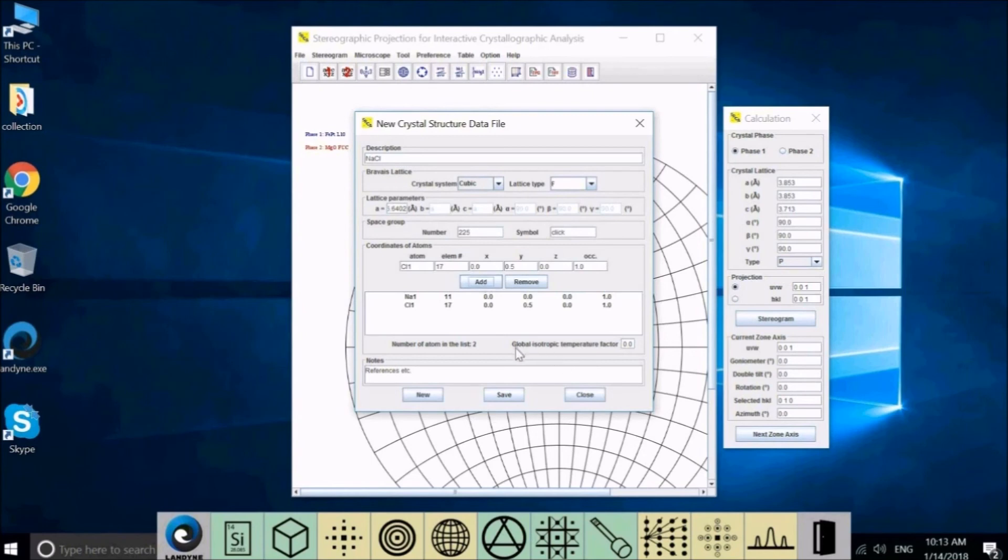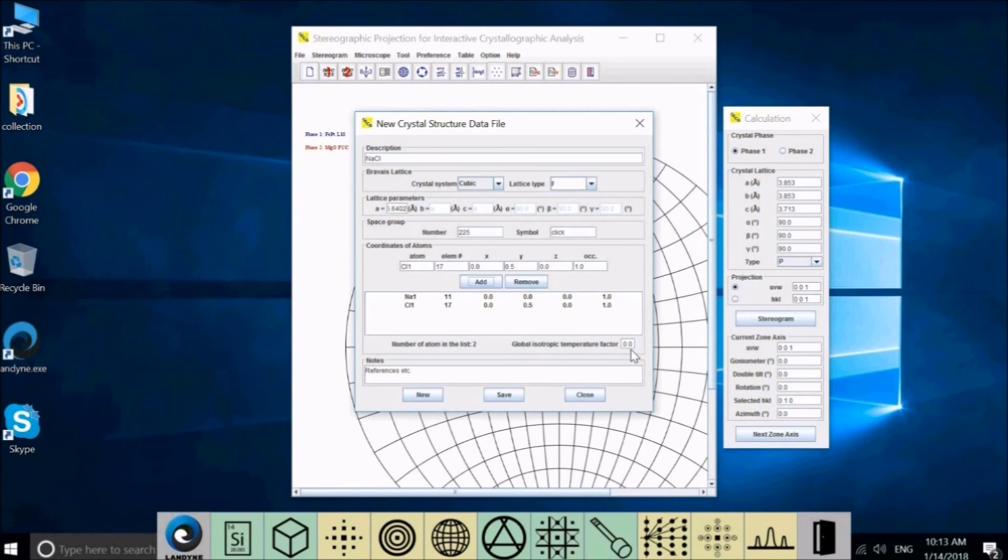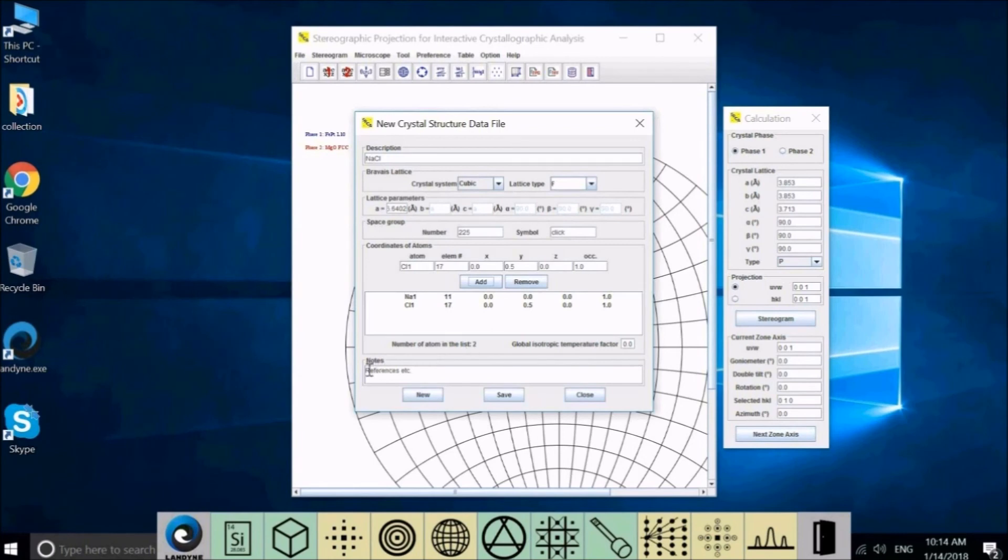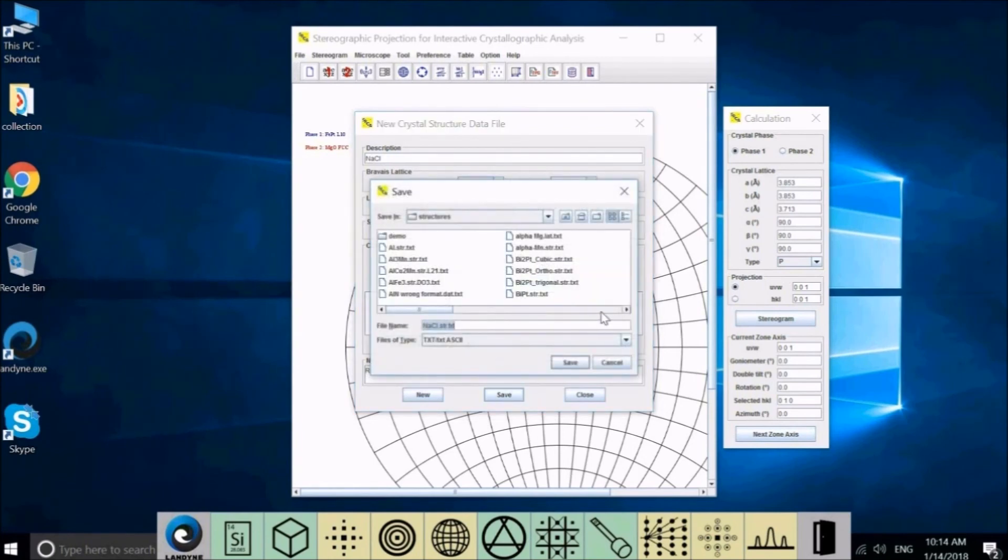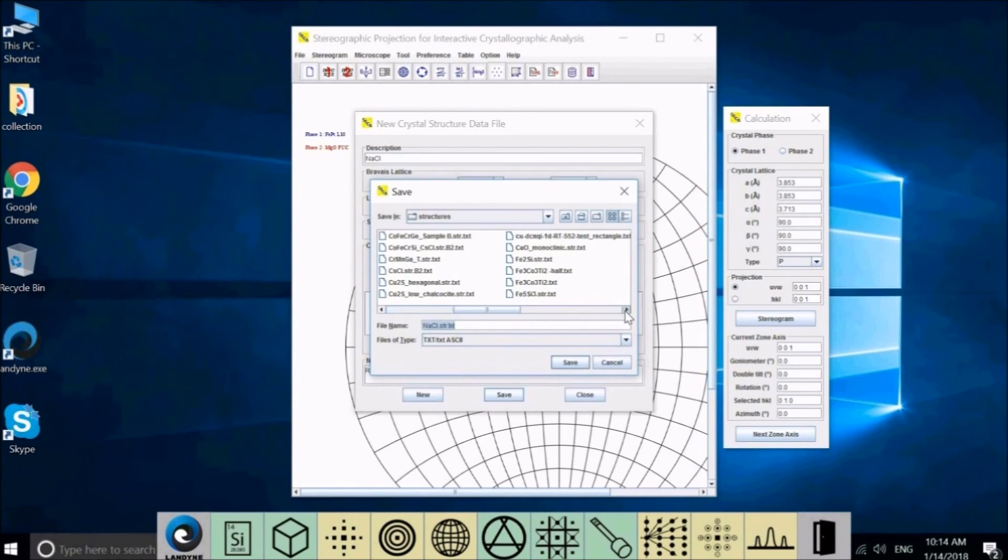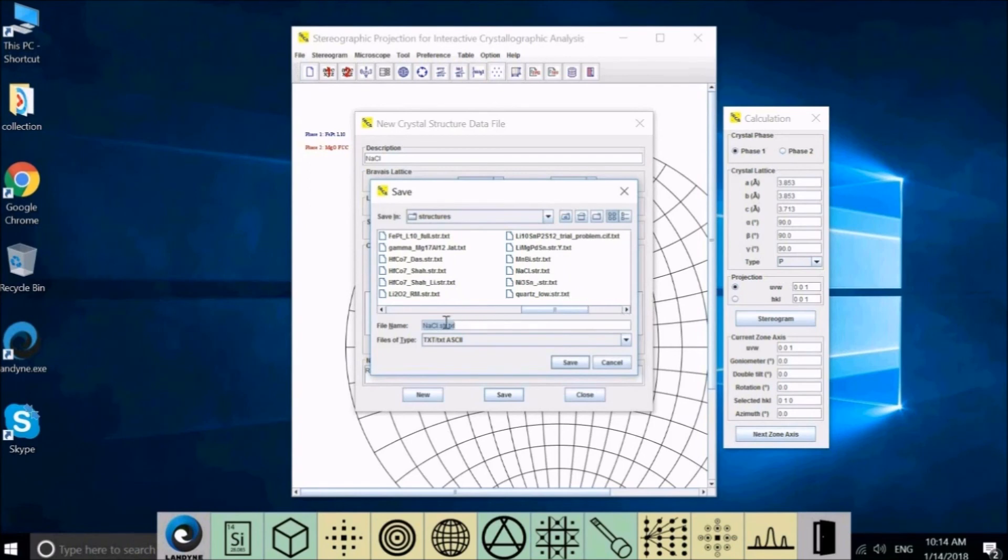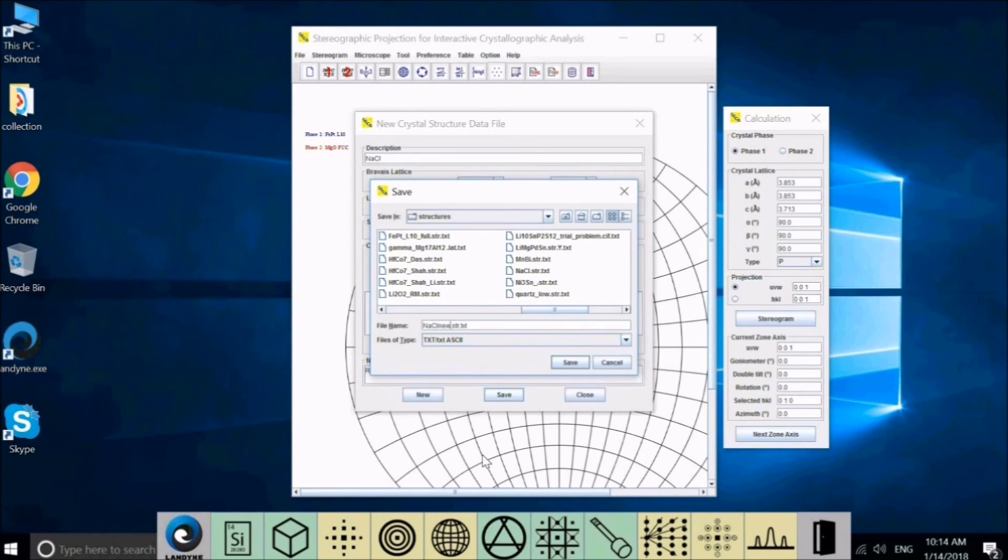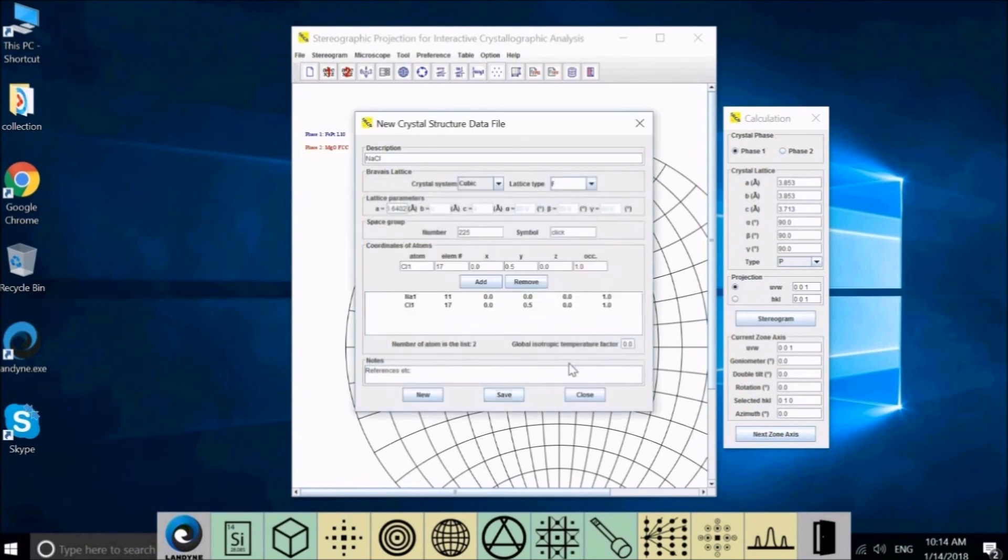Here is global isotropic temperature factor. Usually we just put a zero. You can put a non-zero like 1, 2, 3. It will decrease the higher G value diffraction intensity. Save. We already have the sodium chloride in our list. You can put a new name here and save.